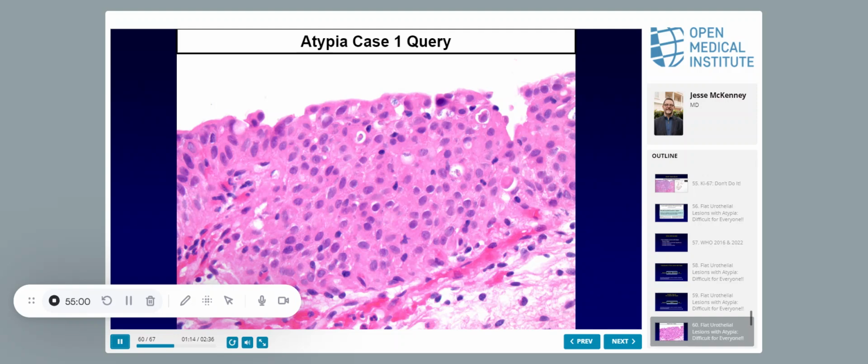So the question is, do I use the term dysplasia? I do not. And again, the reason is it's not reproducible. I can't show you images and say this is dysplasia, this is not. Like, I'm comfortable showing you this is CIS, this is reactive. If I stood up here and told you this is dysplasia, this is not, I feel like I'd be lying to you, and I'm not going to do that. I see thousands of these a year, and I don't think I can do it.